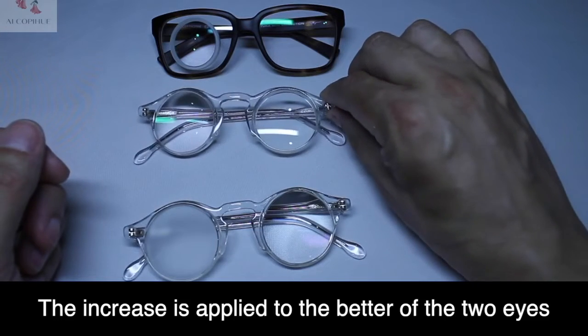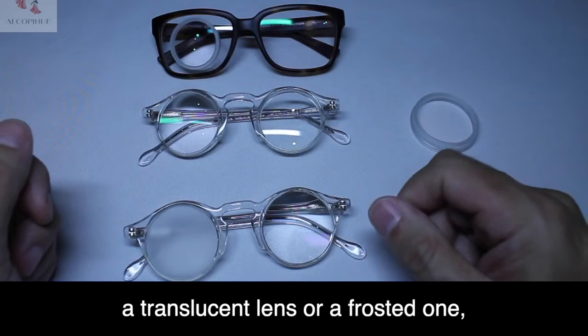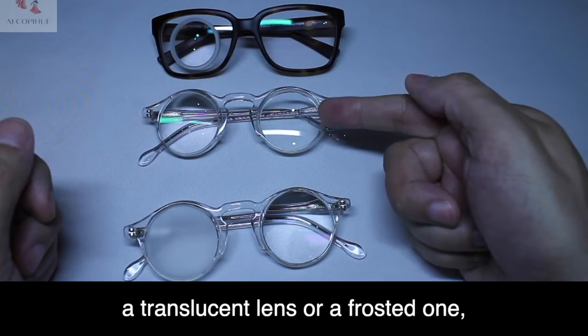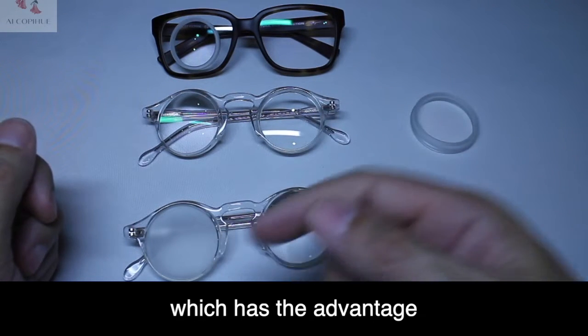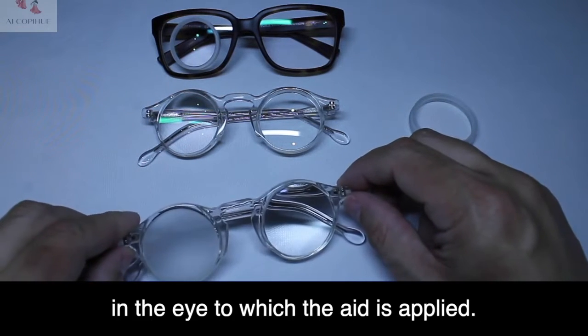The magnification is applied to the better of the two eyes, with the other eye having either a translucent or frosted lens. This has the advantage of allowing the patient's vision to concentrate in the eye to which the aid is applied.